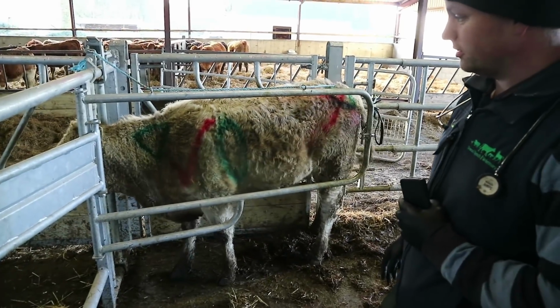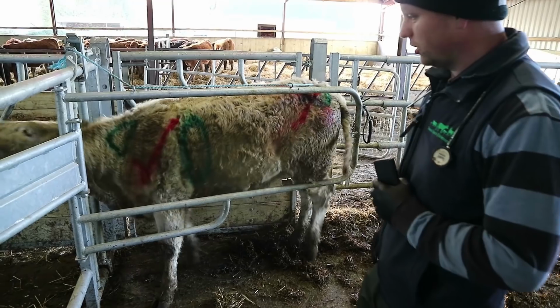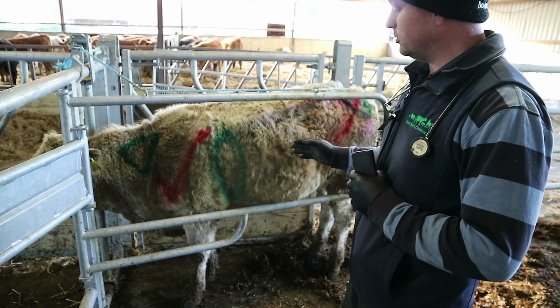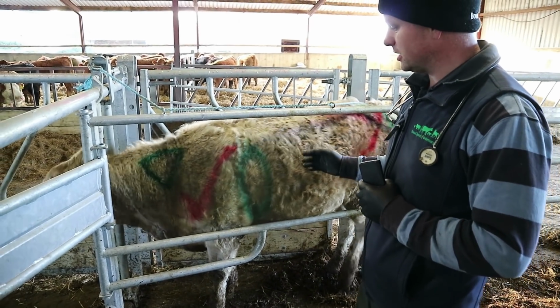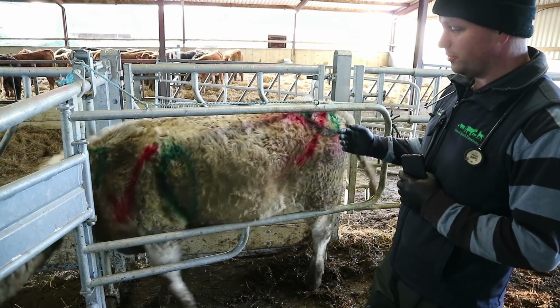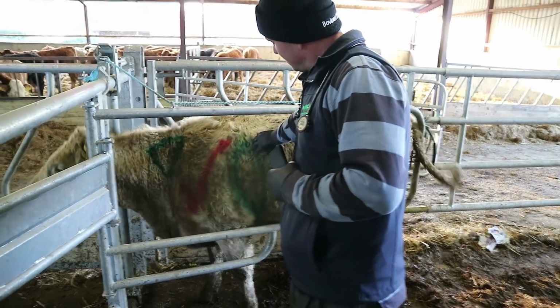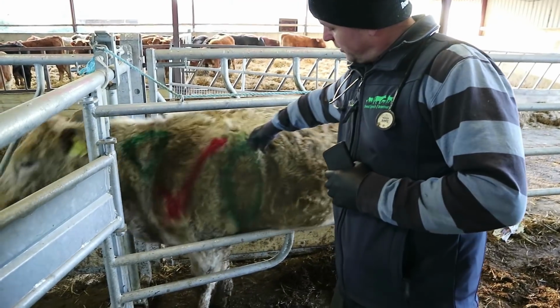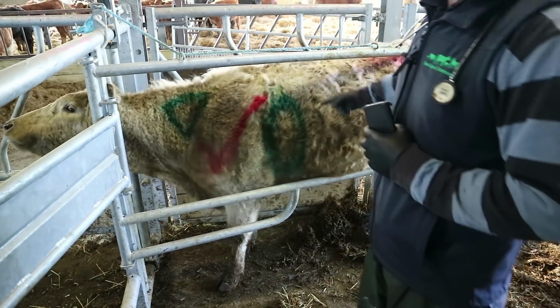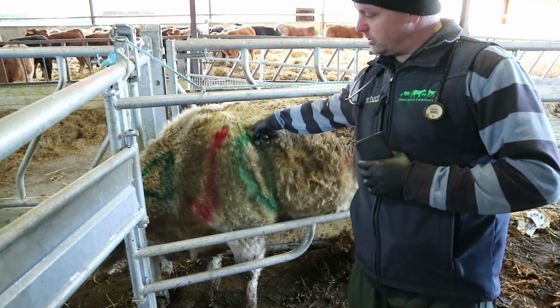And is there any issues with injecting under the skin behind the shoulder? What way you have to face the needle, or at the top of that circle, the bottom of that circle? Okay, when we're injecting into the muscle, we're going to be going straight in with the needle. When we're injecting under the skin, we're going to be going in sideways. Now, some people will catch a fold of skin and hold it out to inject. Other people will just aim the needle sideways. So when you catch a fold of skin here on this animal, you can feel the skin will come out easily enough like that. So you can do that and you can inject. Otherwise, you can just get your syringe and go in at an angle like that, and you're going to end up under the skin or subcutaneous.